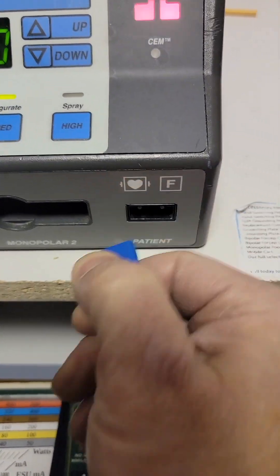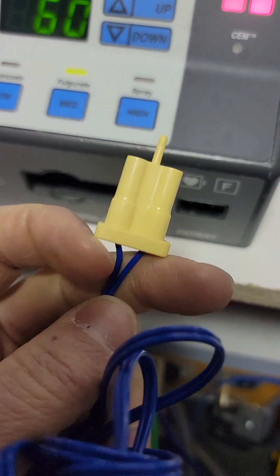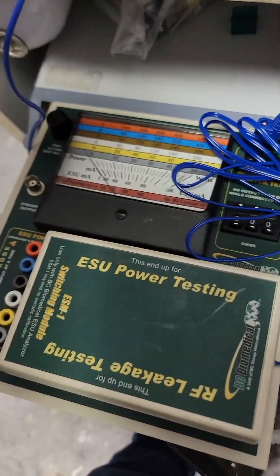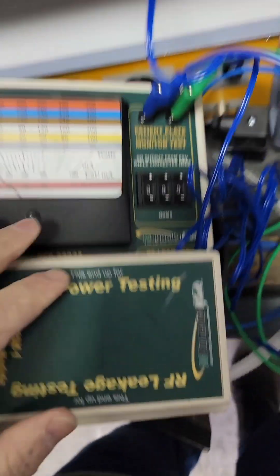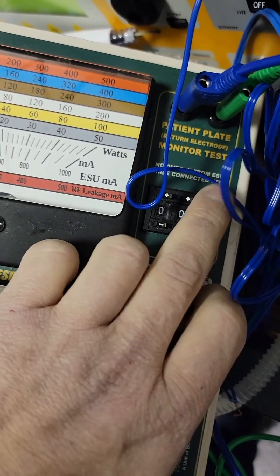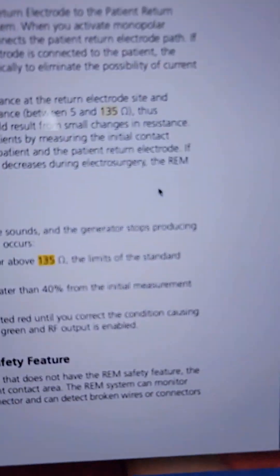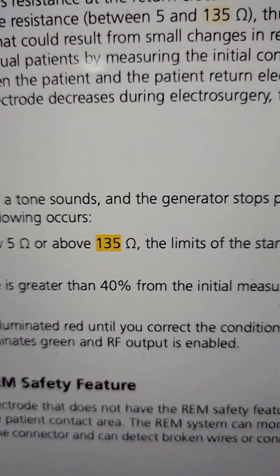For this test you need the lead with the pin on it. To test the ESU you need a pencil, some banana leads for the bipolar, and two RIM leads — one with the pin broken off, one with the pin intact. Using the BC Biomed ESU-2008 analyzer: plugged in at 0 ohms, we're red. Jump up to the 5 ohm mark — we're green. Going up slowly: 6, 7 — and there it is. We've got an increase in contact resistance greater than 40% from the initial measurement, which activates the alarm.